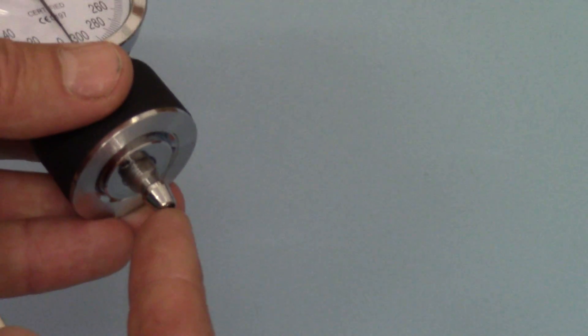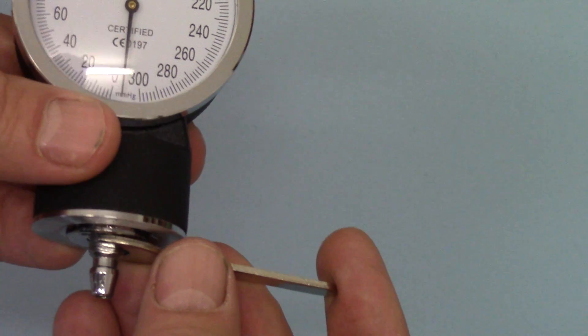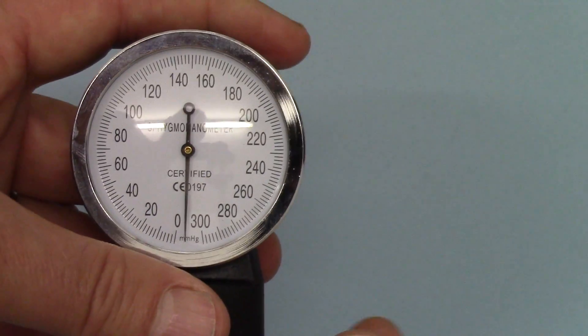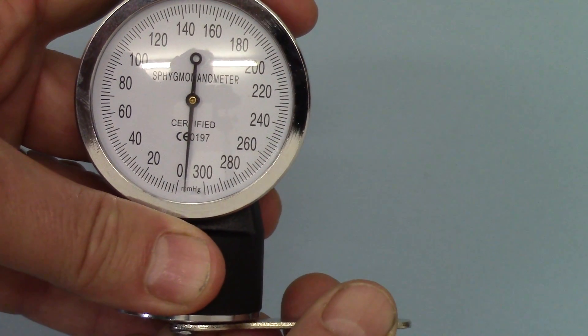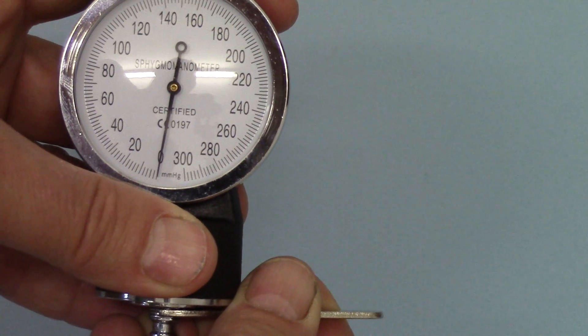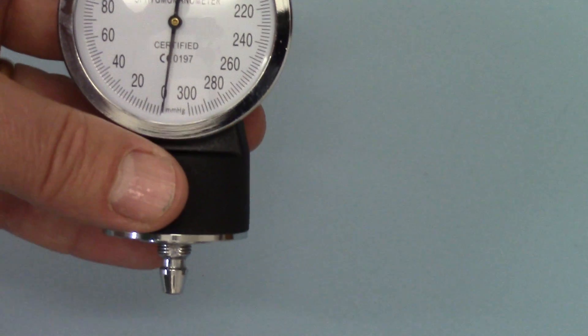At the base where you connect the tube and before you connect the tube there's a little flange where this fits just snug on the base of the aneroid unit and to adjust it it's just a very gentle movement one way or the other until you're happy that it's sitting exactly on zero and when it is it should stay there.